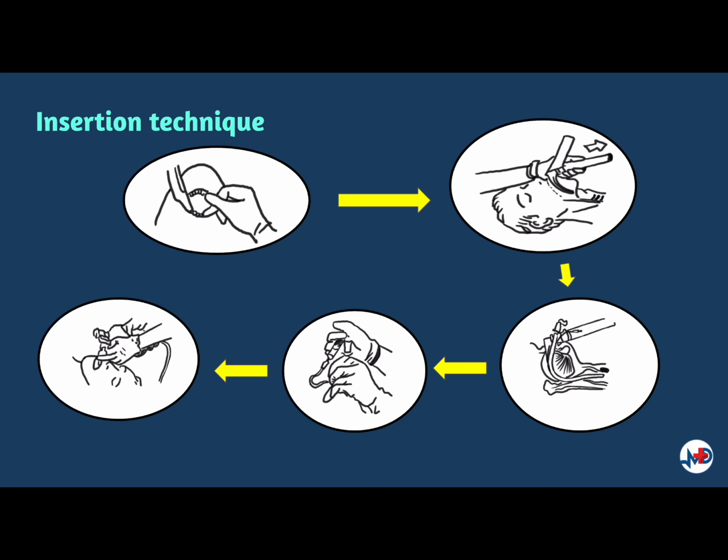Pass the laryngoscope down the tongue, slide it down the right side of the mouth until the tonsils are seen, and move it to the left to push the tongue centrally until the uvula is seen. Advance over the base of the tongue until the epiglottis can be visioned. Next, lubricate the end of the endotracheal tube and insert it in the groove of the laryngoscope so that the cuff passes through the vocal cords.